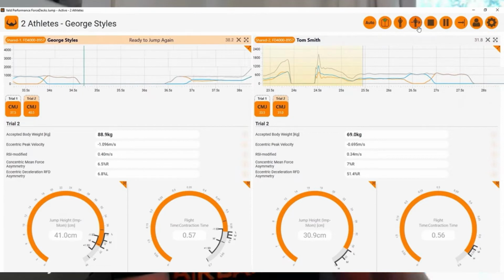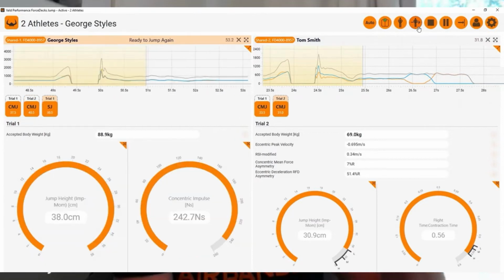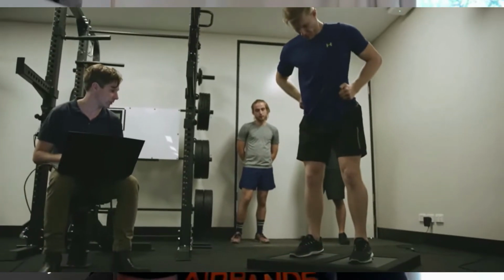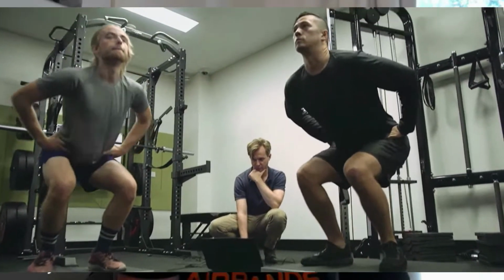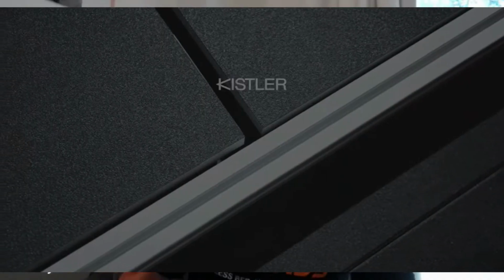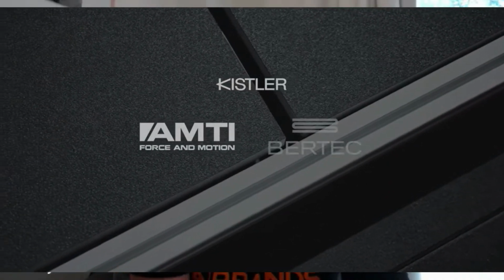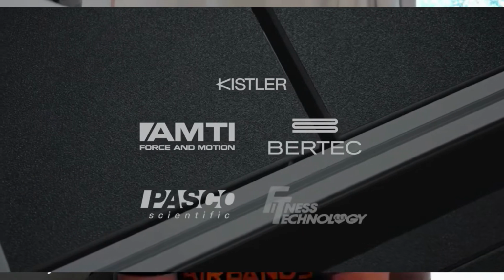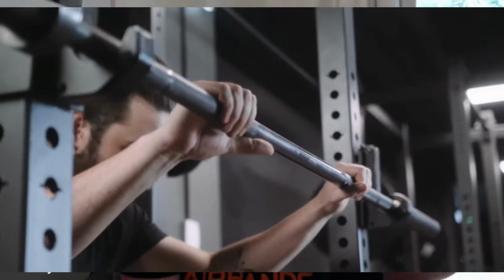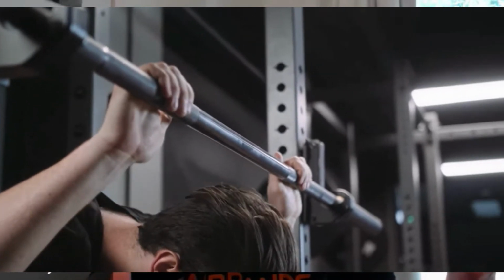specificity of certain movements, whether that's a squat, a vertical jump or a landing, and looking at time to absorption or time to stabilization. And then when you start looking into, let's say, broad jumps or things where you're going in another direction, you take it with a grain of salt, knowing that that's still very valid data from the y-axis, but you're not getting a true representation of what everything's doing.